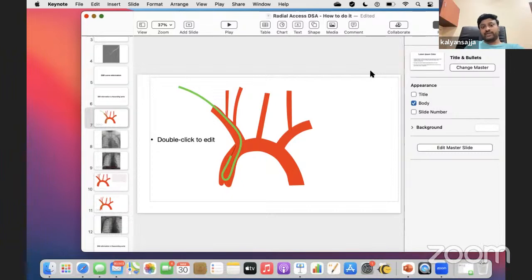There is also an Envoy 7 French, but the inner diameter is 078. I was disappointed by that because Envoy typically gives very good support, more support than the Fubuki, but the 078, I don't think it will fit a Cat 5 or Cat 6.